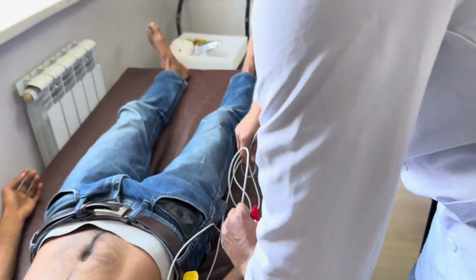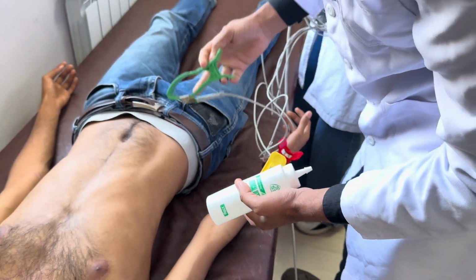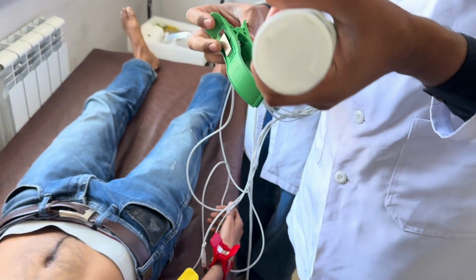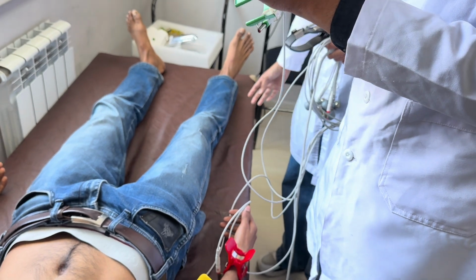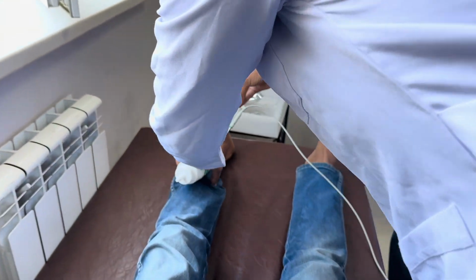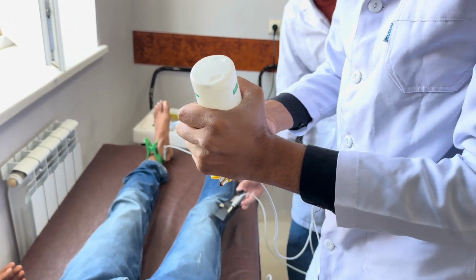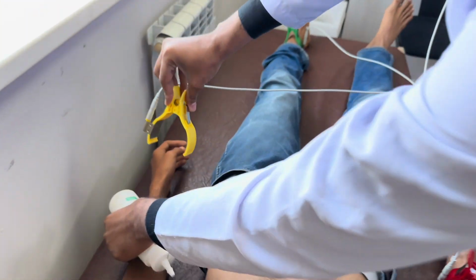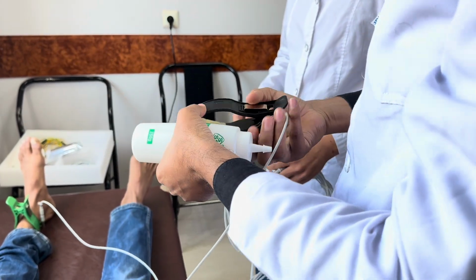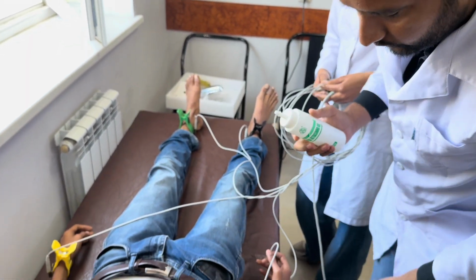We apply gel and the red lead on the right hand. At the arm, it's called the AVR lead. Green on the left leg. And yellow on the left hand, the AVL lead. Black is a neutral point. Okay, good. Then we adjust the chest leads.